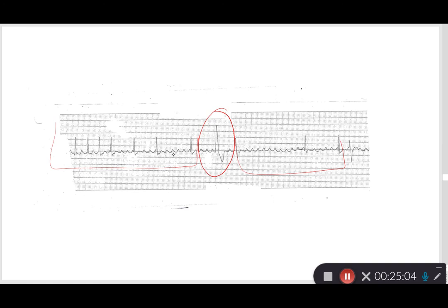So, 1, 2, 3, 4, 5, 6 here. 1, 2, 3 here. 1, 2, 3, maybe even 4 there. 1 there. And 12 flutter waves there, and 6 here.